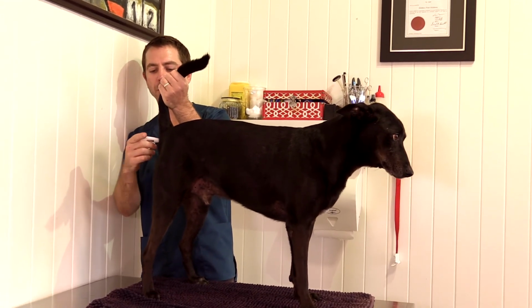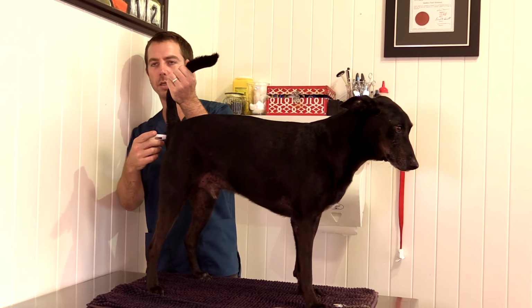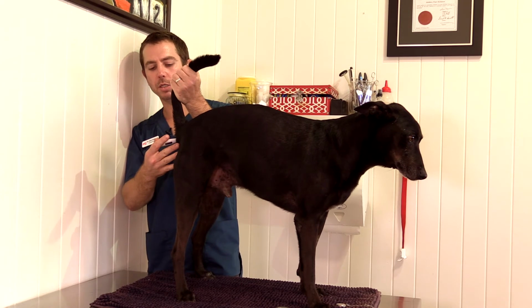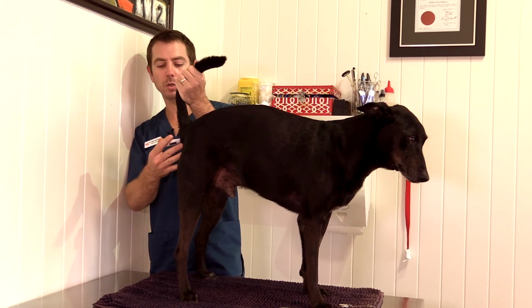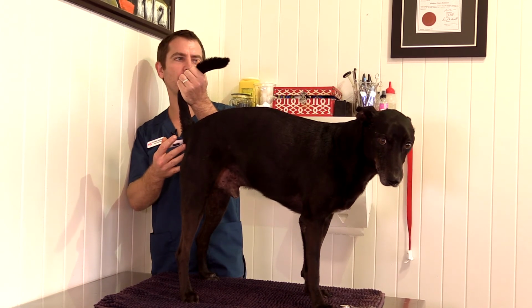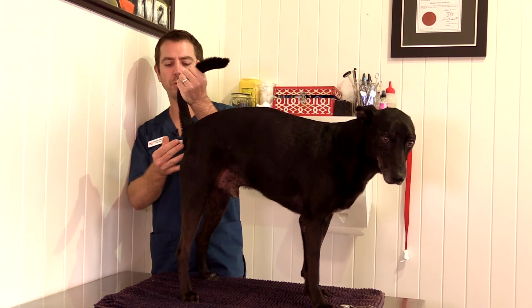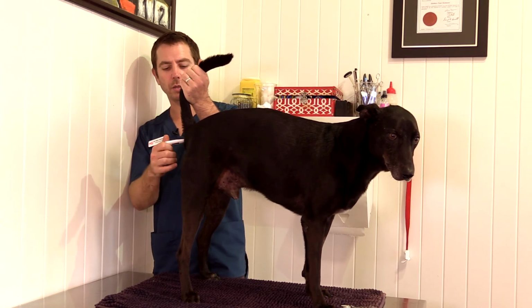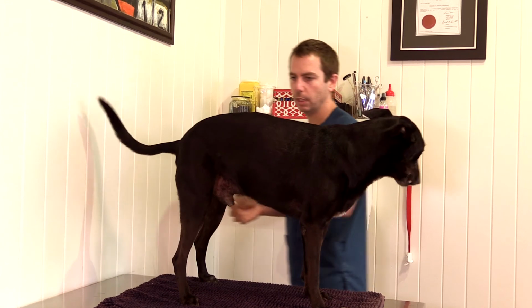And then I'm actually pushing it to the side so that the thermometer is coming in contact with the rectal wall, and then his temperature is 38.6, so that's normal. I usually go on 38.3 to 39.3. I think in the notes it might say 37.8 to 39.3 or something. That's fine. He's 38.6, so I'm not concerned.